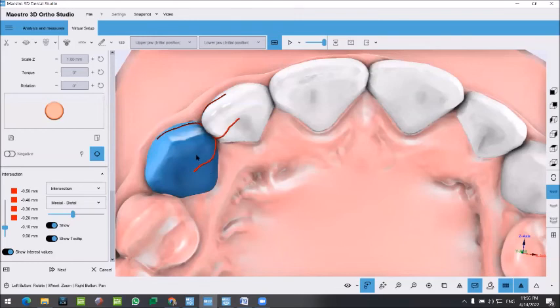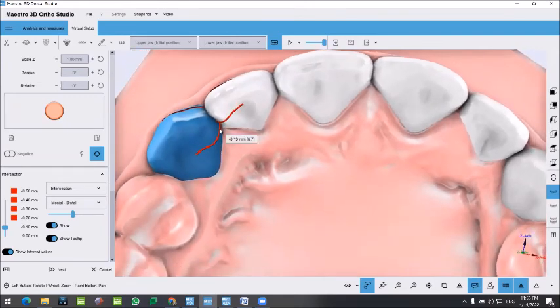So all I need to do is move number 6 a little bit more so the intersections can be good enough for any IPR. So you see it's 0.19. For me, that's good. It's going to be rounded up to 0.2. That's okay for me. So I'm going to tell the doctor to do 0.2. The doctor will not see the software.